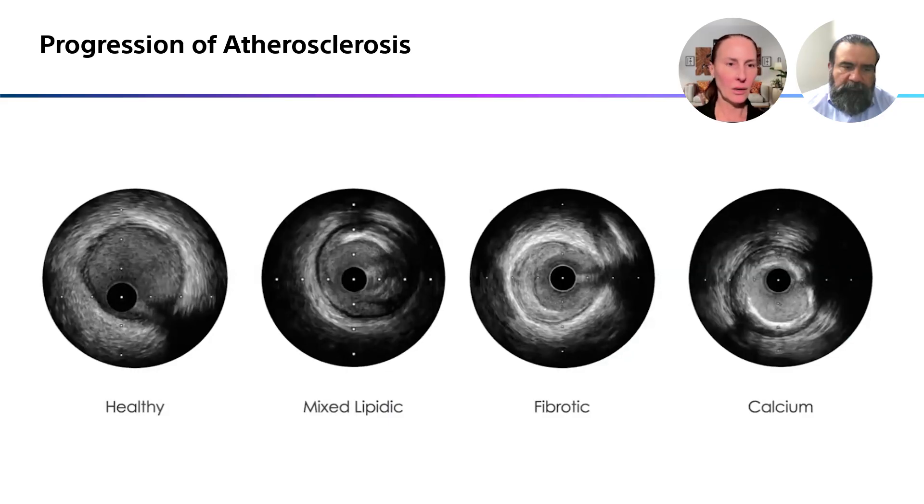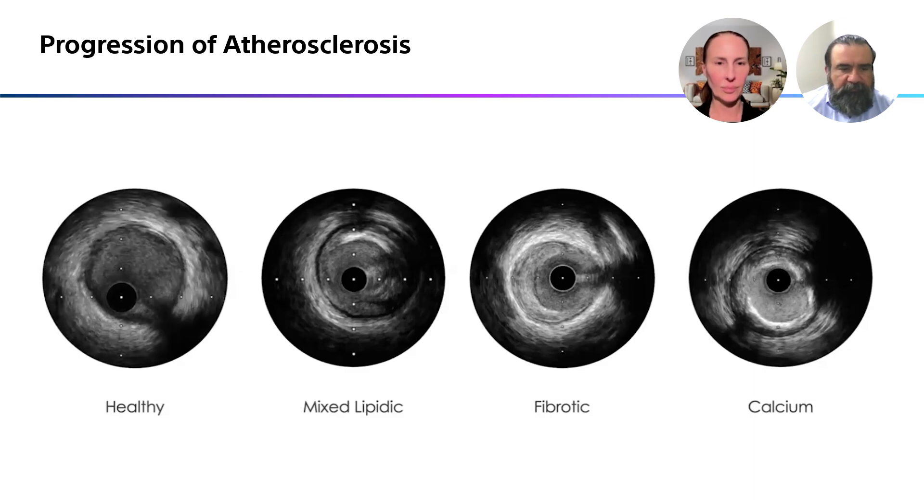There are a lot of different things we see on intravascular ultrasound. To the far left is a healthy artery — you can see a nice adventitia, very minimal intima or media. To the right of that, you're starting to see some mixed lipid plaque, a little bit of calcium around noon. The next one, the fibrotic one, you can see the adventitia very well with fibrotic tissue. And then to the right, you can see an arc of calcium that's almost 360 degrees, but not quite.